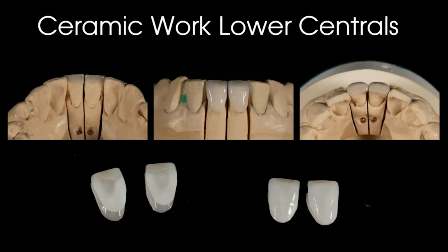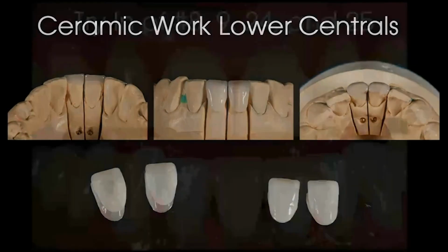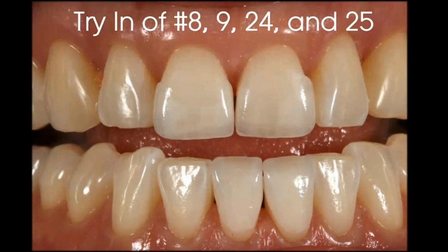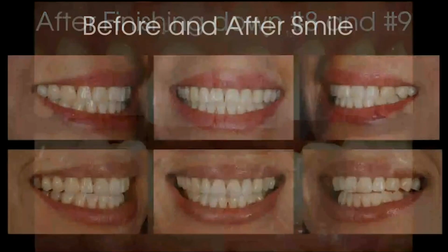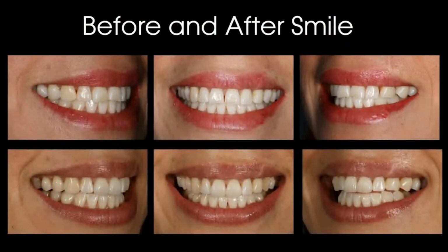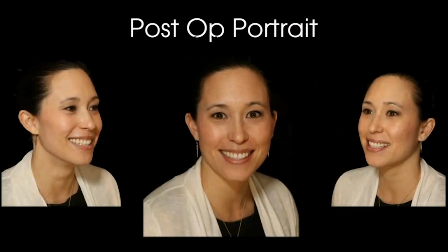And so here's the case, trying them all in. You can see the shape. I'm going to have to recontour a little bit when they're cemented in. So after finishing down 8 and 9, that's what the case looks like close up. And that's what her smile looks like before and after. And you can see that by reshaping it, it looks like they fit on the anterior, and so that's the post-op portrait. So a nice conservative result for her.